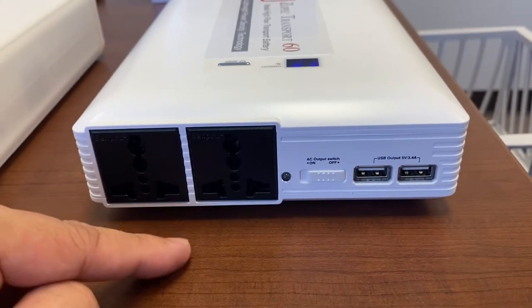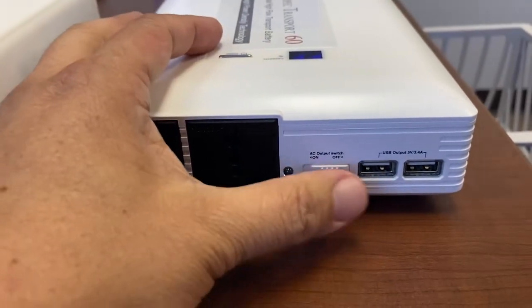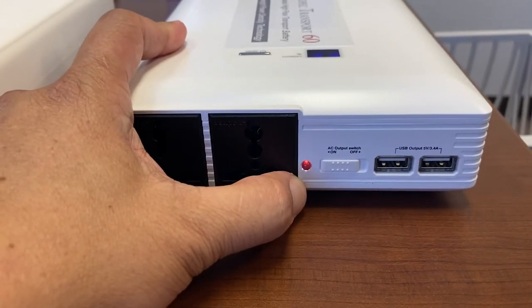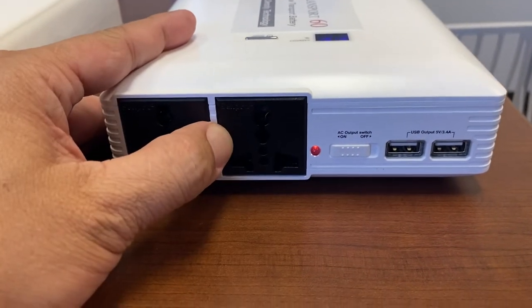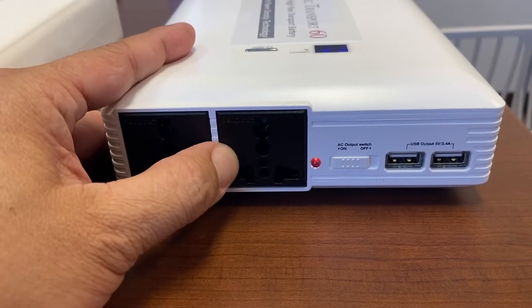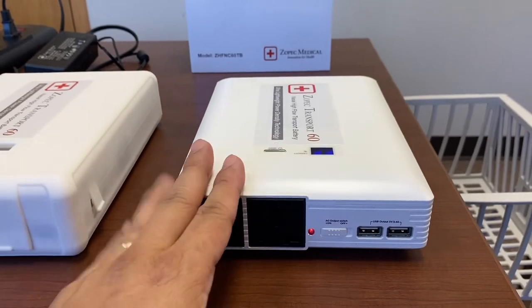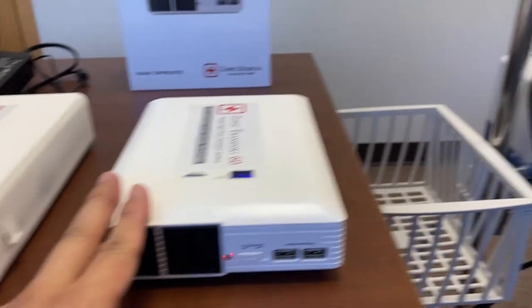To turn on the AC outlets you have to slide the AC outlet switch, and when the red LED is on that means there is power to the AC outlet. You do not need to plug the battery into the wall to start the AirVo2.